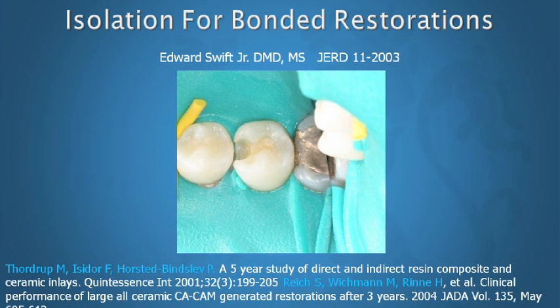After we have finished our preparation, now we go into our isolation. And I know some people really feel, especially when we're in dental school, we really get drilled on the fact that if we don't use a rubber dam, we're doing substandard dentistry. And the truth of the matter is that research doesn't substantiate that statement. In fact, research shows that whether we use a rubber dam isolation or we use cotton roll isolation properly done, the results are consistently the same.